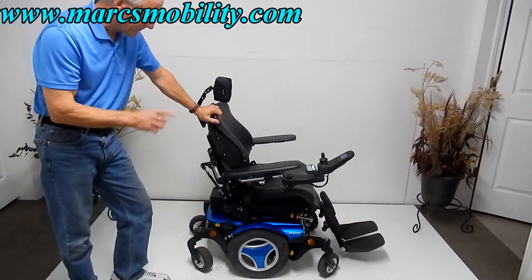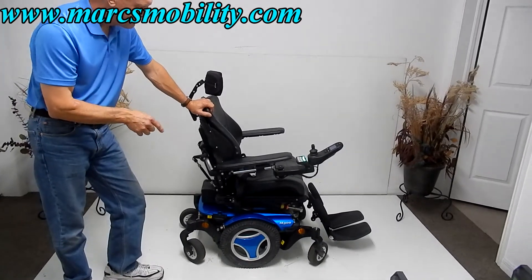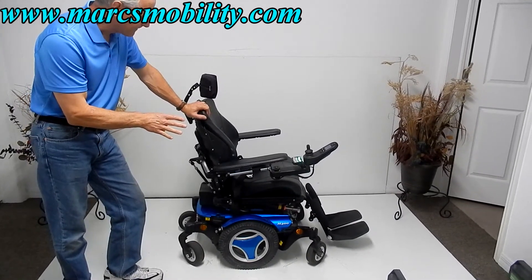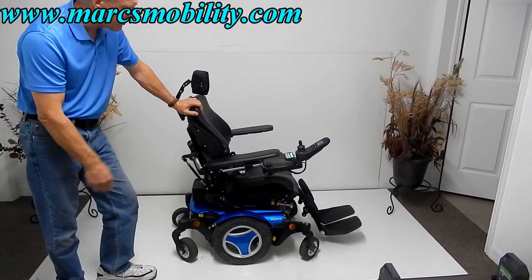So you have electric tilt, electric recline, electric seat lift, and electric legs. It's a used Permobil — used for about a year and a half to two years. The price is going to be a little less. It's in great condition; I don't see any scratches on it, so whoever had it took care of it.